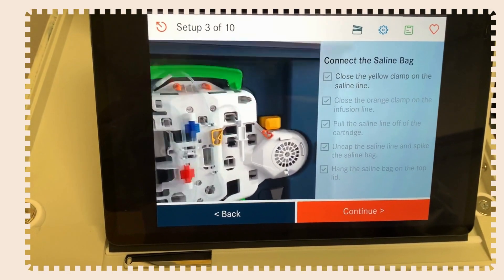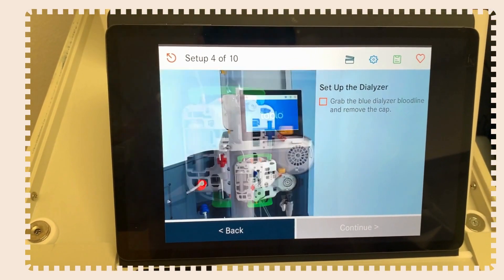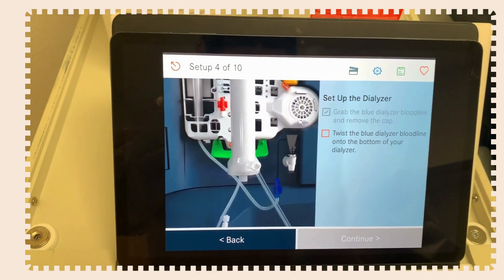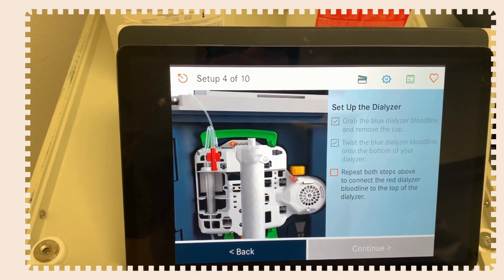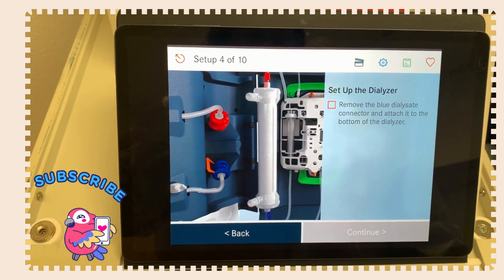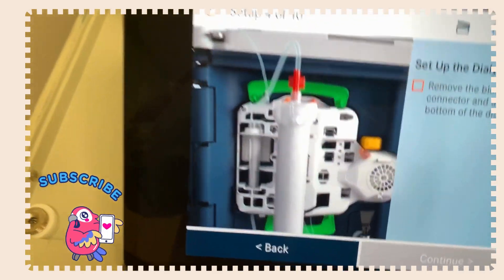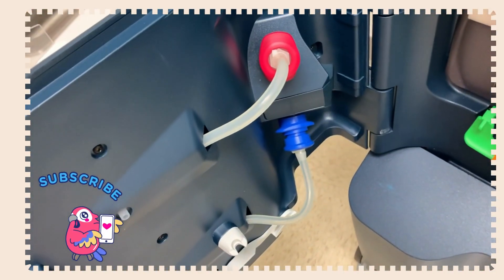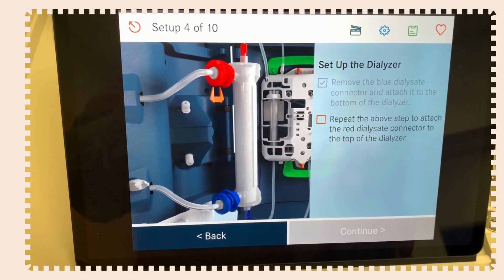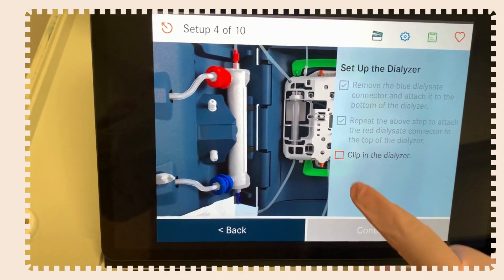Grab the blue dialyzer bloodline and remove the cap — it's shown clearly on the display, so there's no way to get this wrong. Twist the blue dialyzer bloodline onto the bottom of your dialyzer. Repeat both steps to connect the red dialyzer bloodline to the top cap of the dialyzer. Then clip in the dialyzer. Most dialyzers can fit into this machine. Hit continue.